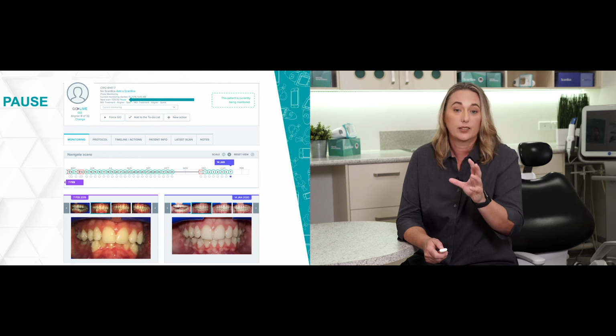But if the patient can't scan for a period of time and they don't want to get bugged about why they're late, use the pause feature. It's a really, really valuable tool. Modifying your protocols and your product for patients that are having orthodontic surgery is a really powerful part of DM.